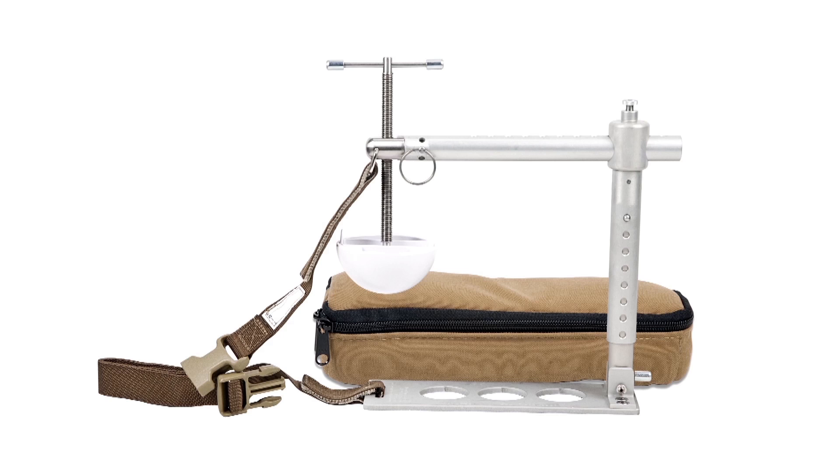This is the Croc, the Combat Ready Clamp. Battlefield proven and TCCC recommended for junctional hemorrhage control, the Croc has a vise-like compression disc that provides the distinct life-saving advantage of creating bi-directional pressure exactly where it's needed most, stopping collateral flow and controlling hemorrhage.